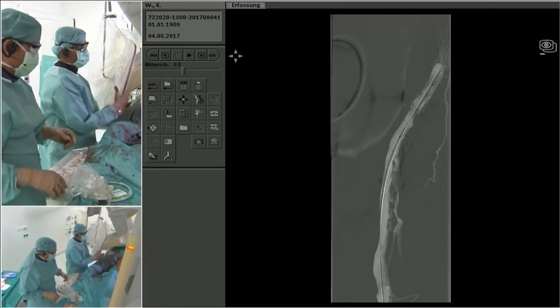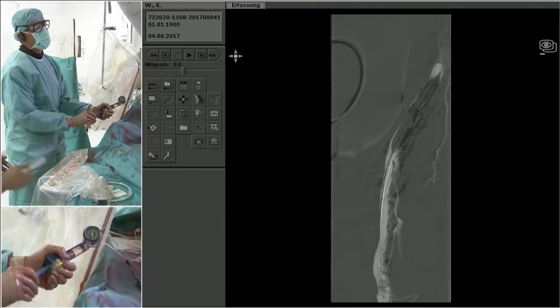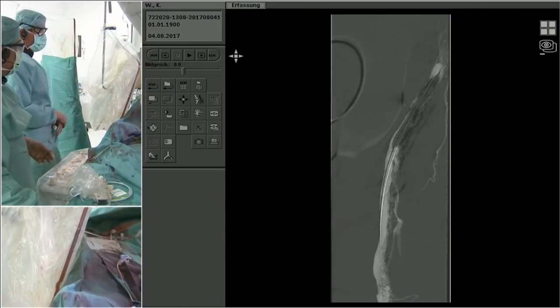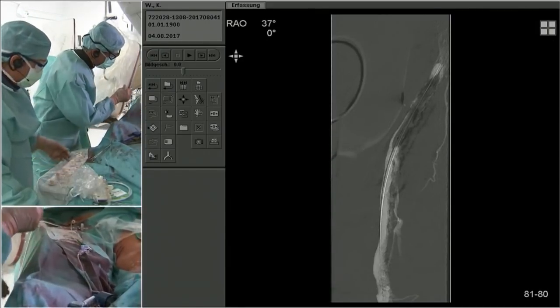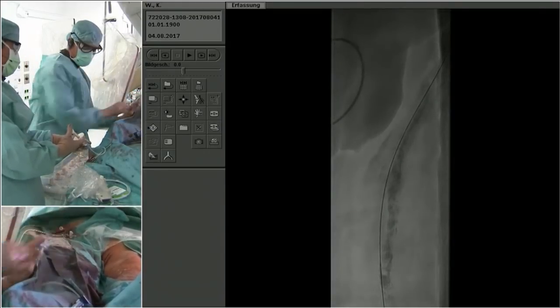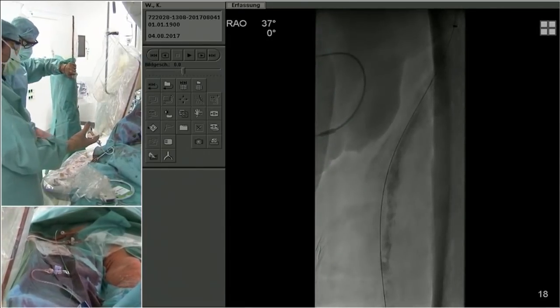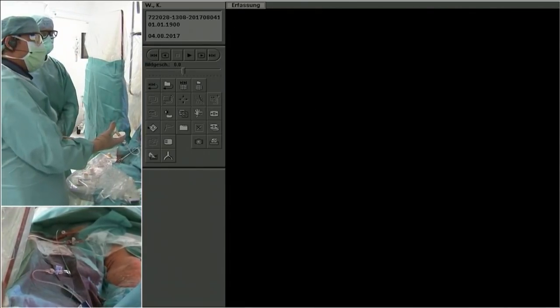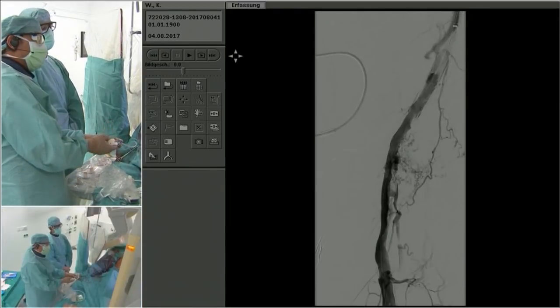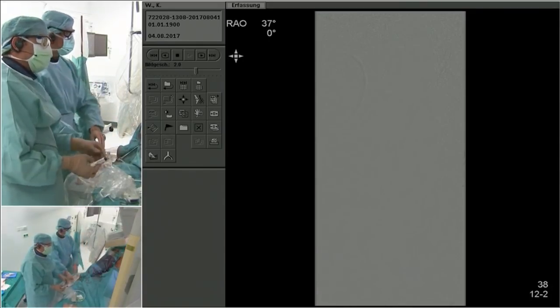You know, the ability to go retrograde has really largely eliminated the need to use crossing catheters. Yeah. I think it's so important, how much time Andrej is spending to pre-dilate this lesion. To me that's the most important teaching point, to be honest, because we typically go in there with one long balloon, we inflate, we get out, we think we have a good result, and it's just impressive the amount of effort he's putting to make sure that this thing is expanded before he commits to some kind of a scaffold.